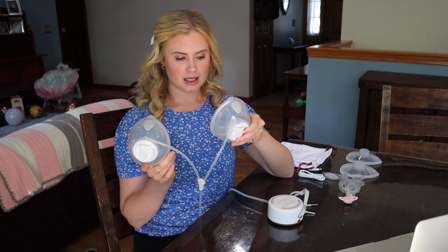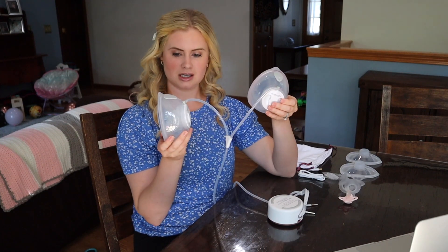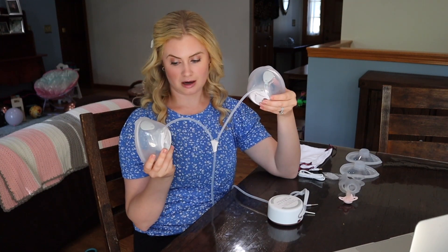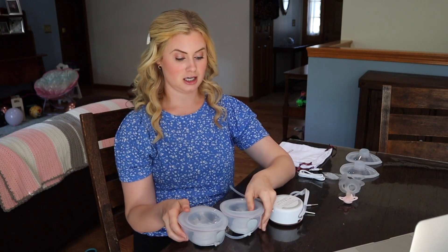A couple things that make this one special. The flanges can hold a lot of milk — they say up to six ounces but you can definitely get more, so they are safe for overproducers. This is also a very strong pump, so if you need a lot of strength you're going to be good here.